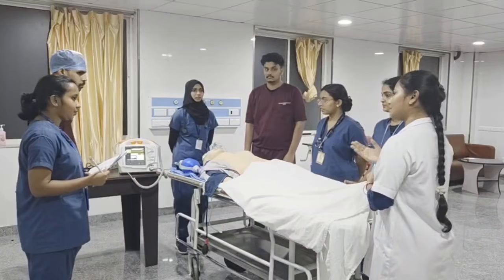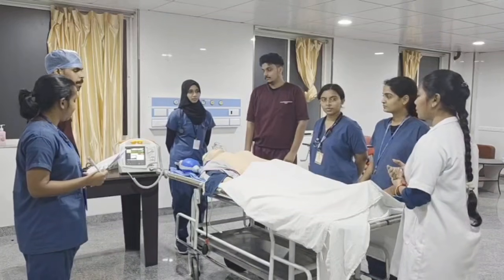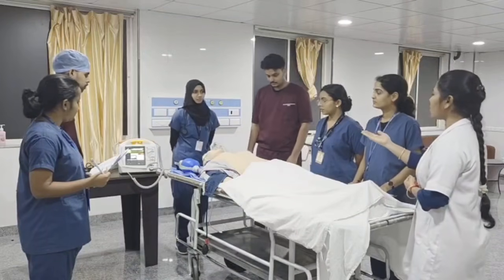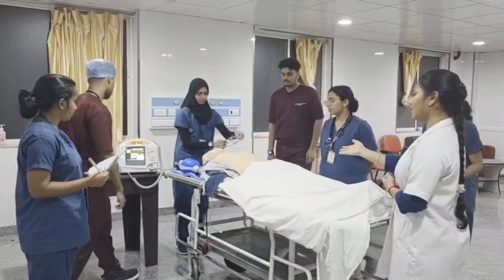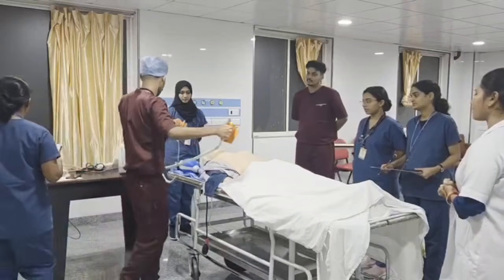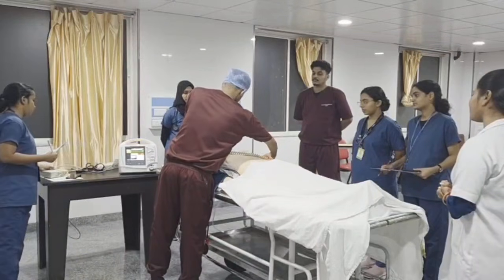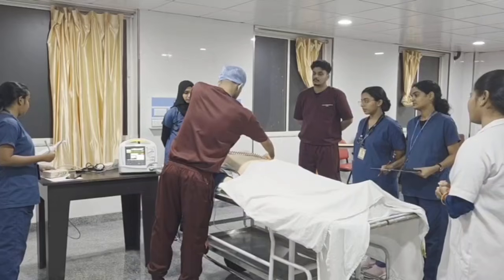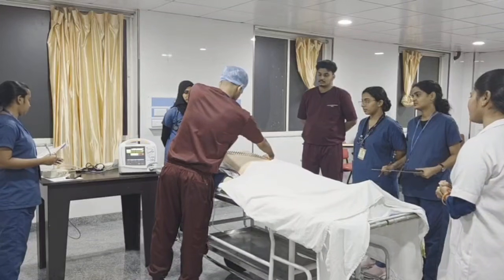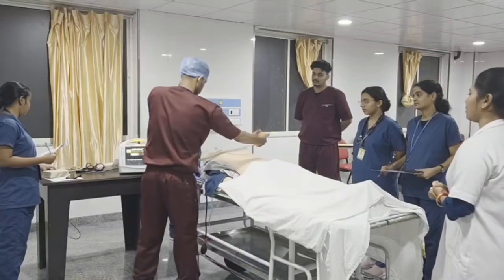Yes. As the rhythm is still the same, it is showing monomorphic VT. We can proceed with the second synchronized cardioversion. Remove the oxygen source. You can deliver the second synchronized cardioversion. Everybody clear? Stay for 10 seconds. Okay.